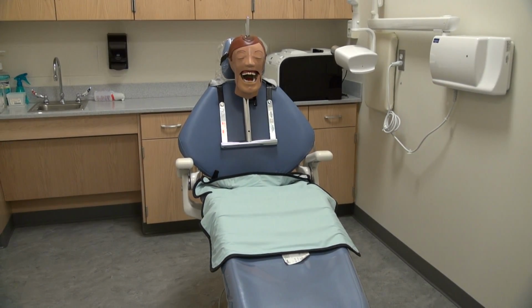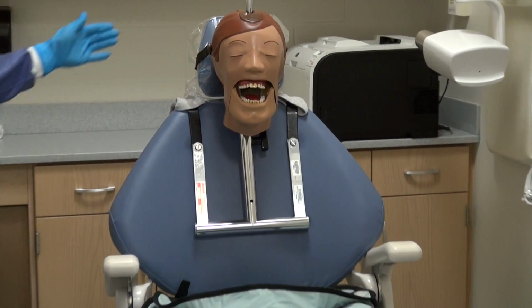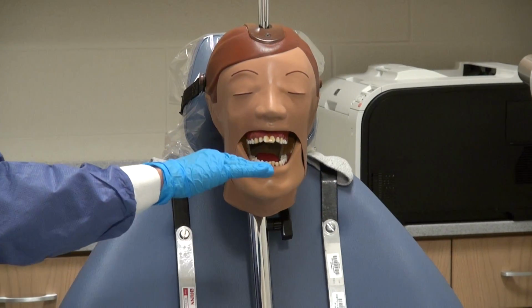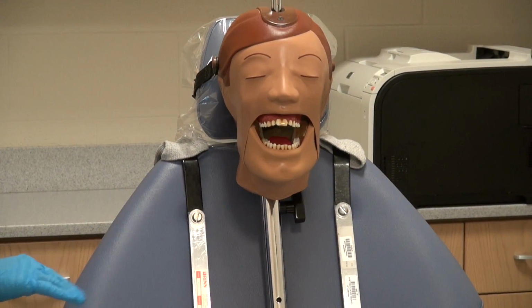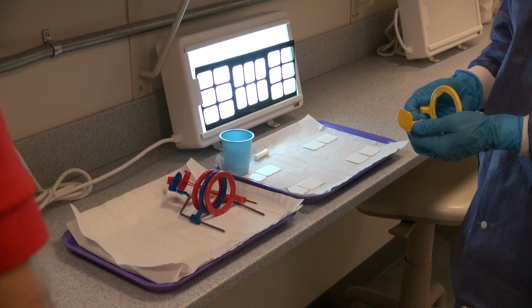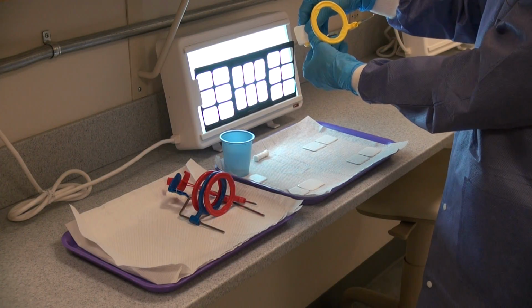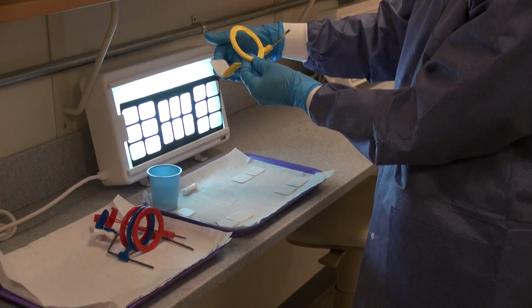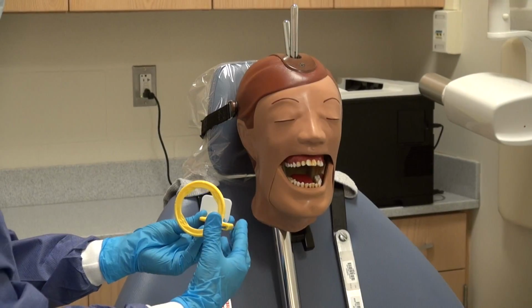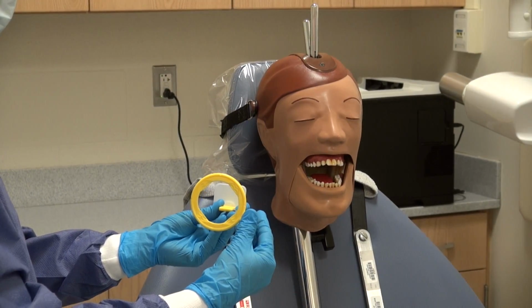He is positioned with his head supported against the headrest. The occlusal plane is parallel to the floor, and the mid-sagittal plane is perpendicular to the floor. We're going to place the film and center it on the bite block, with the dot down, and white is right while looking through the ring. Pull the ring away from the film slightly so there is plenty of room to place the bite block intraorally.